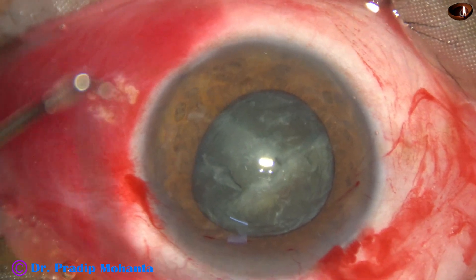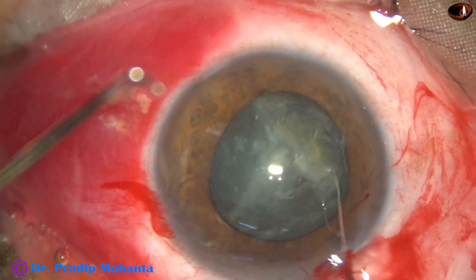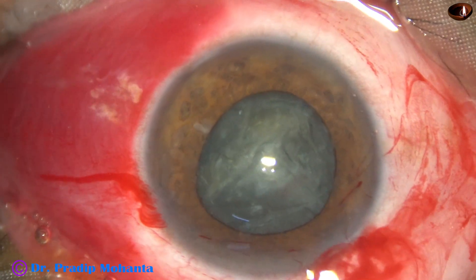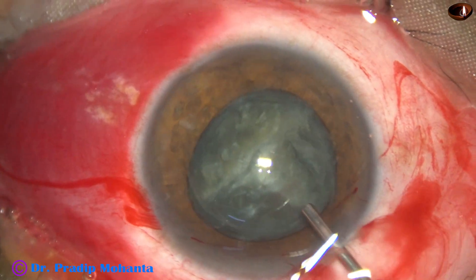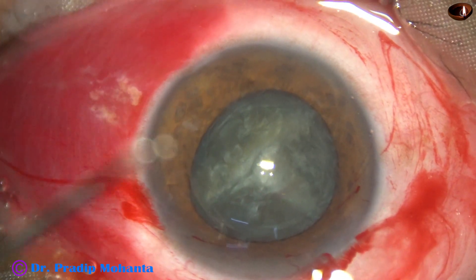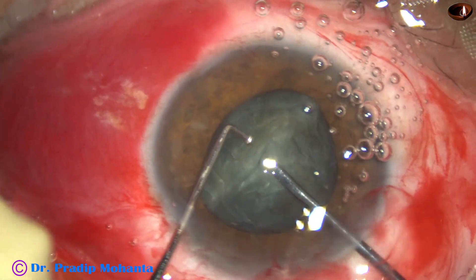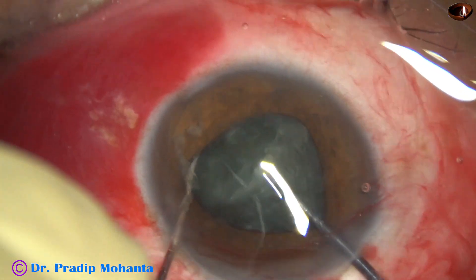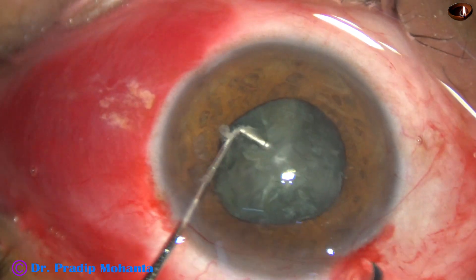The anterior chamber has become shallow, so I inject some more visco, take a hook, rotate, and get the hemi-nucleus to be divided in front. Add some more visco and use the pre-chopper and sustainer again to divide the semi-nucleus into two pieces. So we have got four fragments.